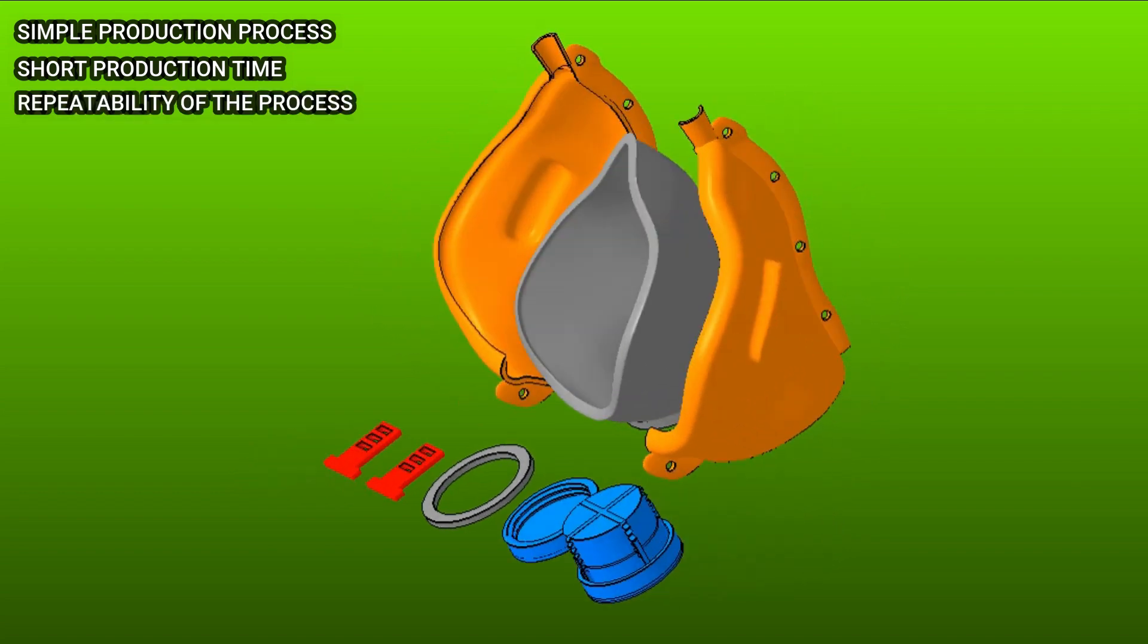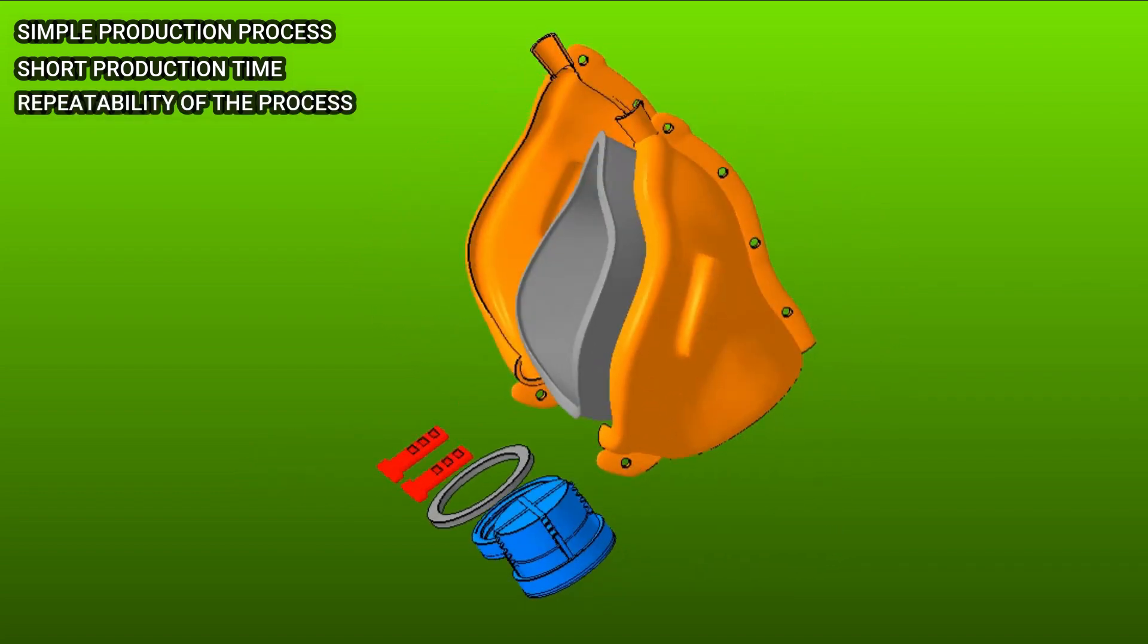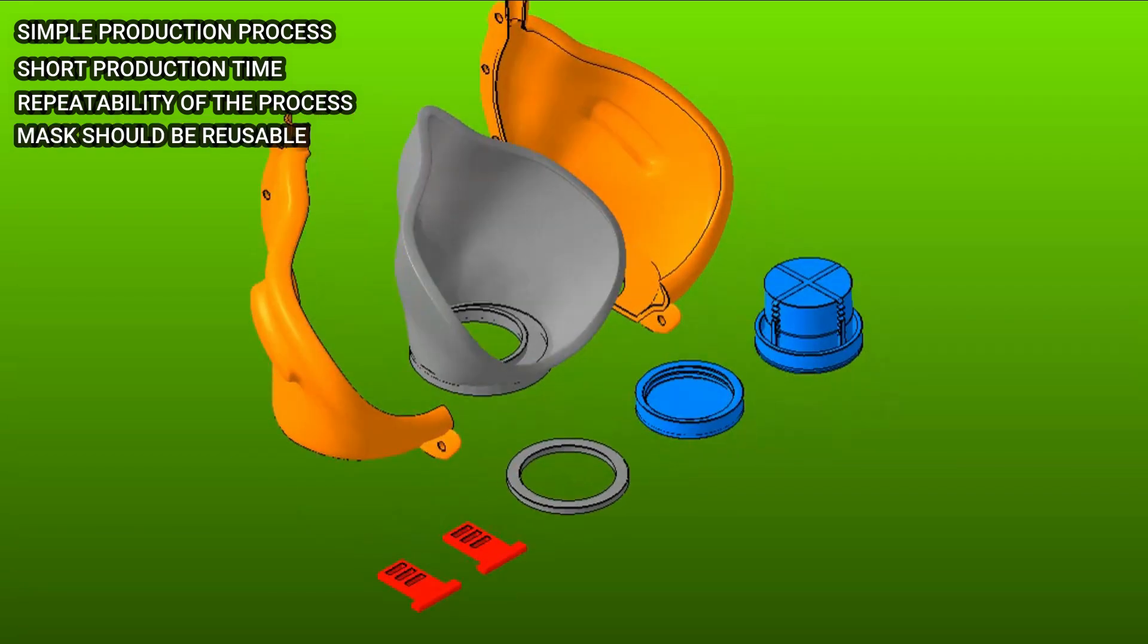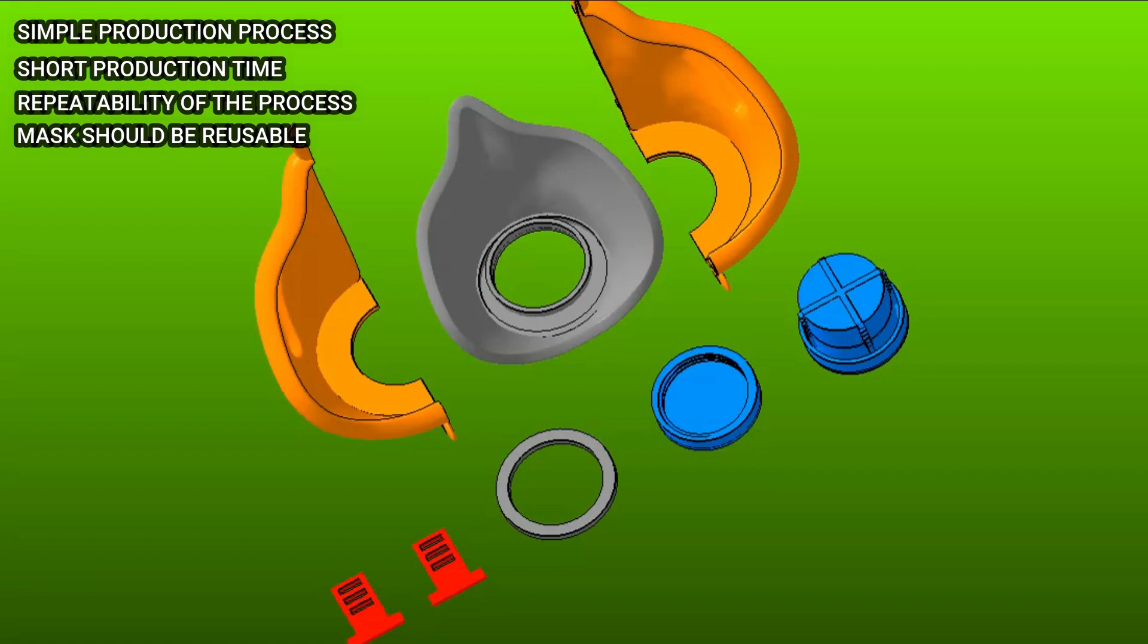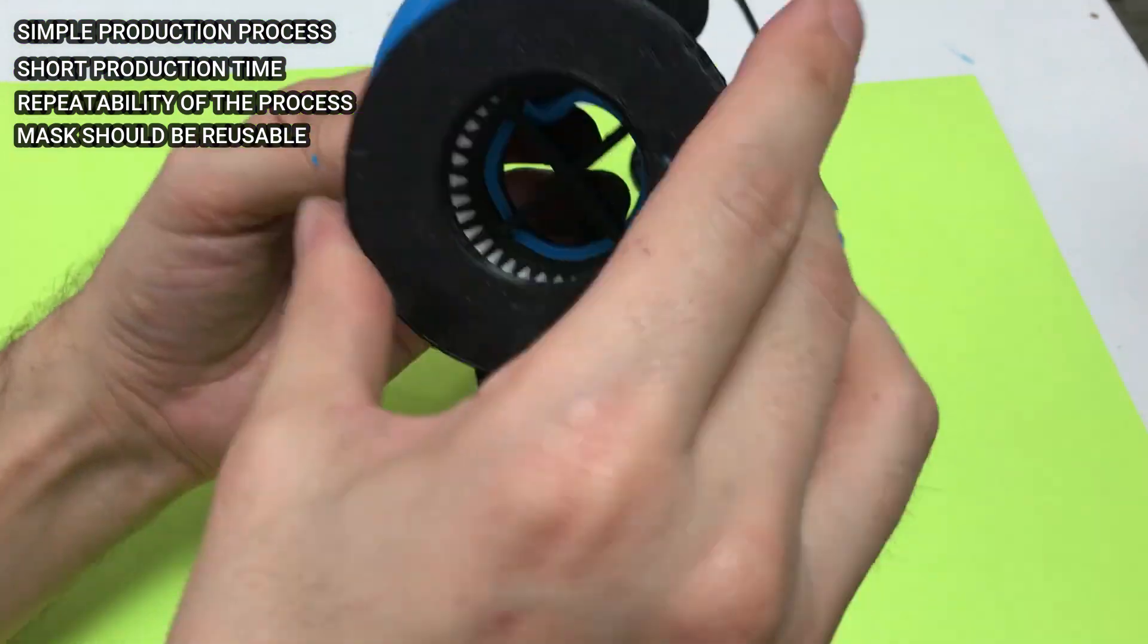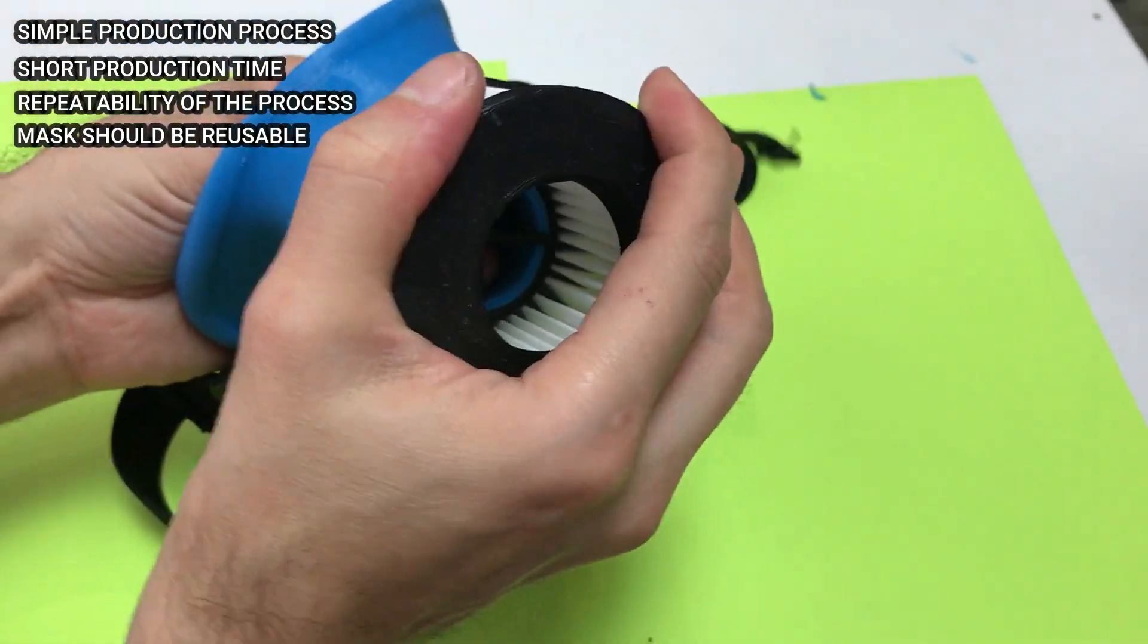Repeatability of the process. One mold can be used for as many masks as you please with the same results. Masks should be reusable. Silicone can be sterilized and reused and the filter can also be sterilized with UV lights and used for three to six months before changing it.